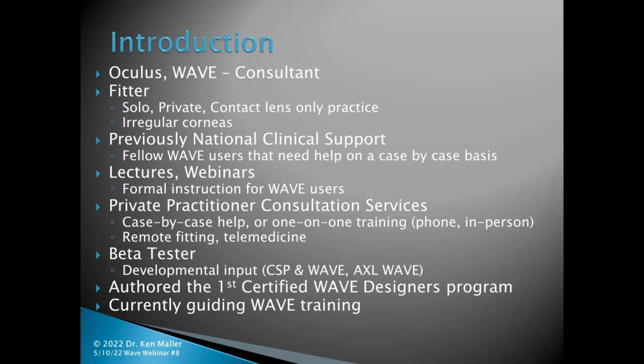I also do beta testing for the software, both on the CSP and WAVE, as well as the AXL WAVE hardware and software from Oculus. I authored the first certified WAVE designers program, and I'm currently guiding the WAVE training so that you guys can get up to speed faster and more efficiently, so that you can get your patients taken care of properly.